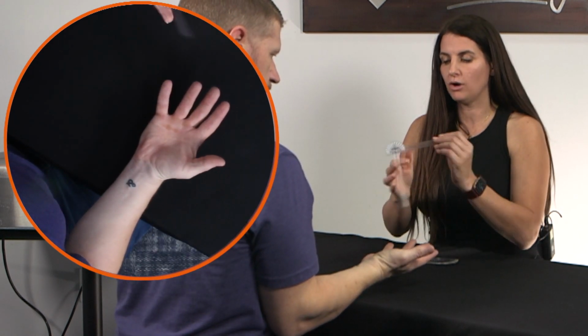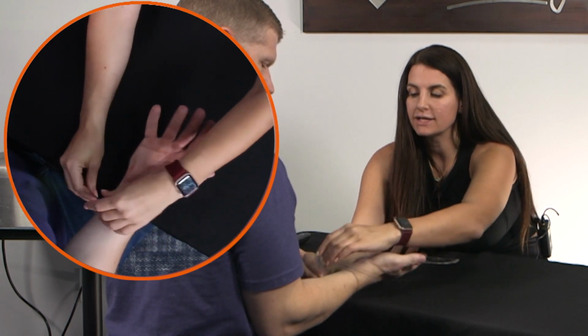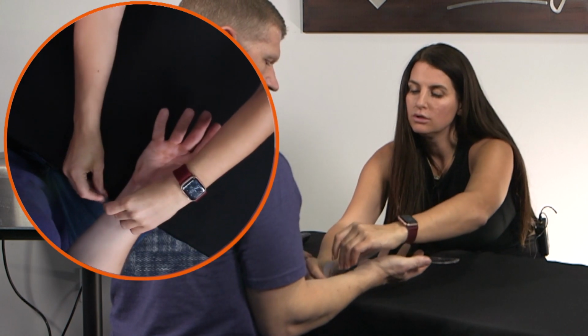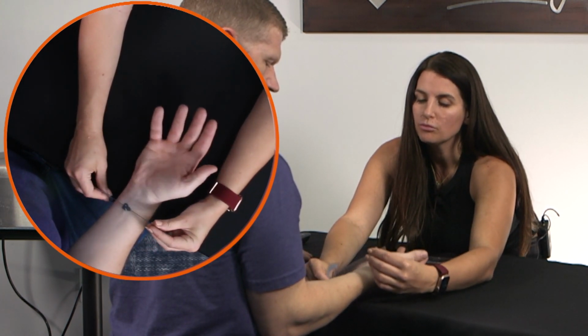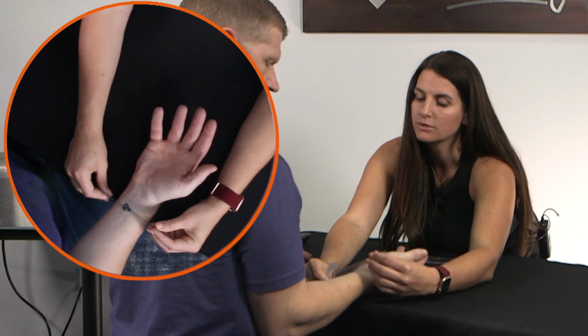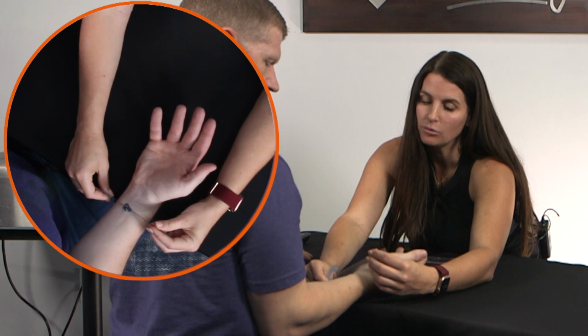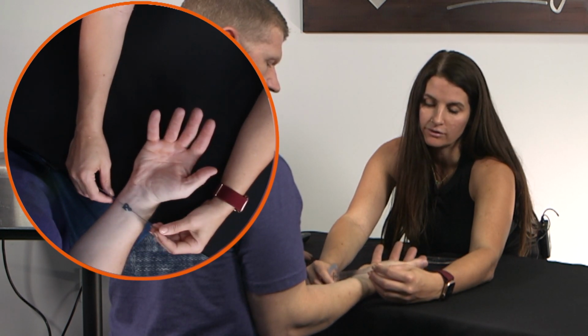With this, you want the one arm stationary, and you want this part exactly up and down, or perpendicular to the movement, and then the moving arm to go with forearm rotation. So if I supinate more, you can see how it goes up to about 75 degrees.